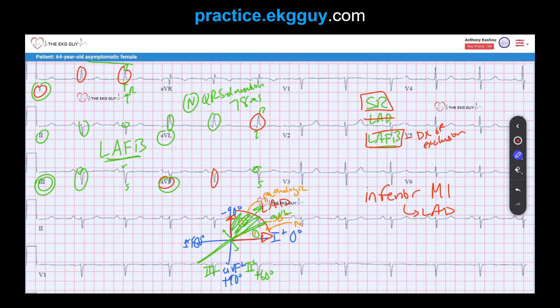A final tip: do not diagnose left anterior fascicular block if the QRS duration is more than 100 milliseconds — two and a half small boxes — except in the setting of a right bundle branch block. Unlike left bundle branch block, right bundle branch block does not affect the initial 60 to 80 milliseconds of QRS ventricular activation used to determine the mean QRS axis and identify LAFB. So remember: shorter QRS duration unless concomitant bundle branch blocks are present.